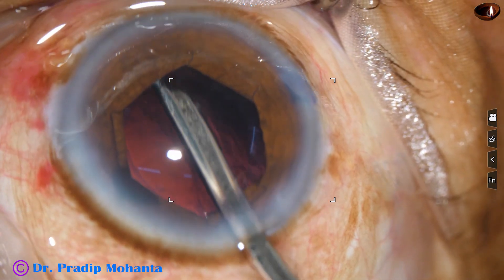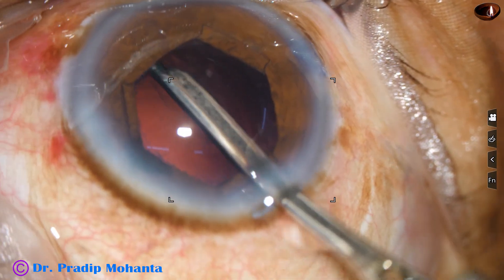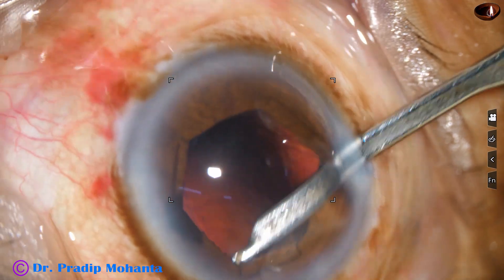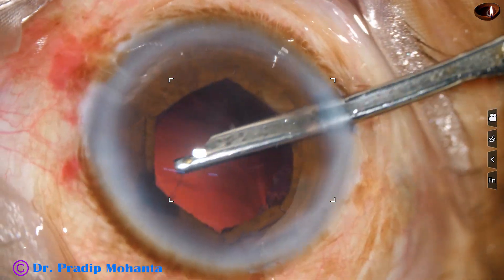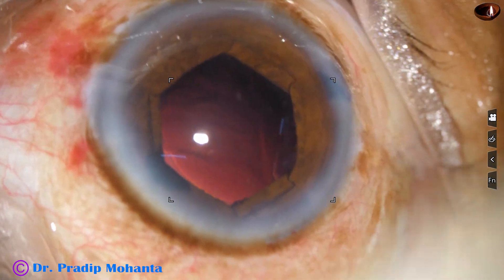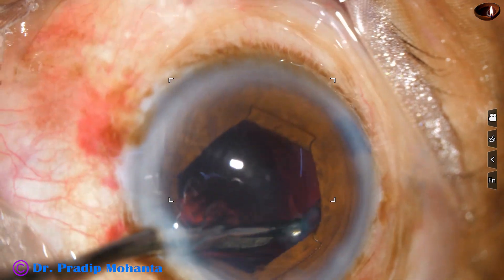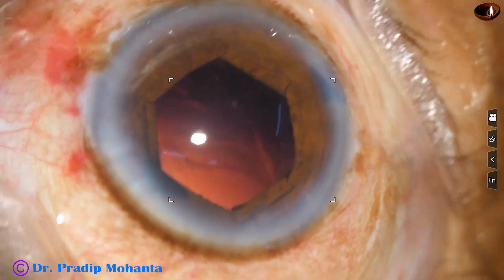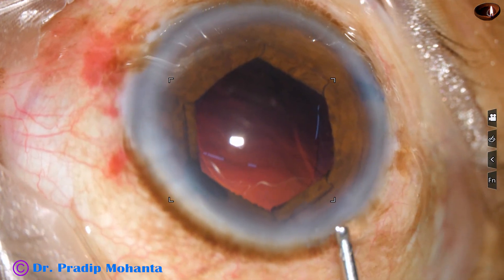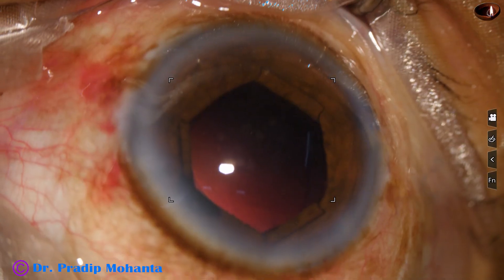Now I aspirate some cortex with the help of this Simcoe cannula. The Simcoe cannula is a very gentle instrument — you can handle it in any way. Coaxial IA and bimanual IA are operated by foot, and they are good. But if you use this instrument, you will find you have more control. So it is safer than bimanual IA or coaxial IA. However, if you develop your skills, you can manage with any instrument.